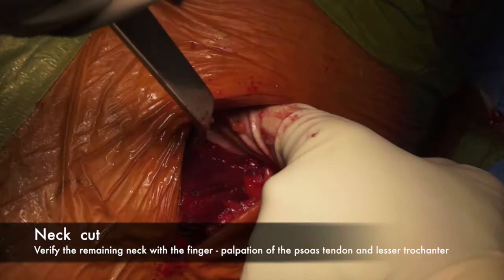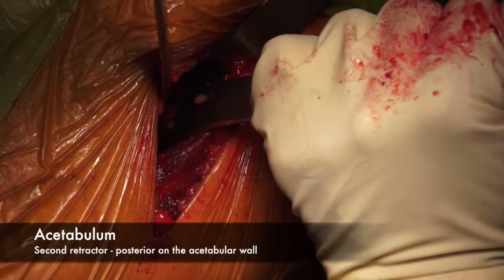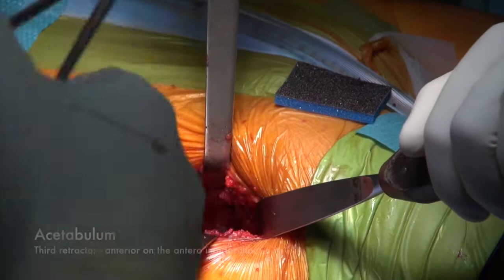Acetabulum, first retractor, inferior on the obturator foramen. Optional while reaming, second retractor, posterior on the acetabular wall. Third retractor, anterior on the anterior inferior iliac spine.